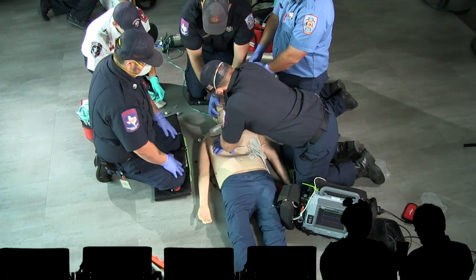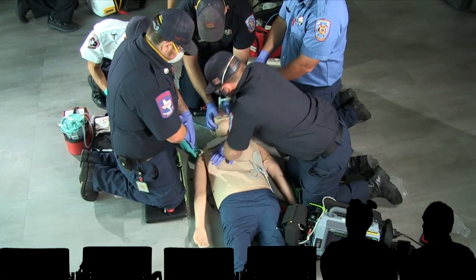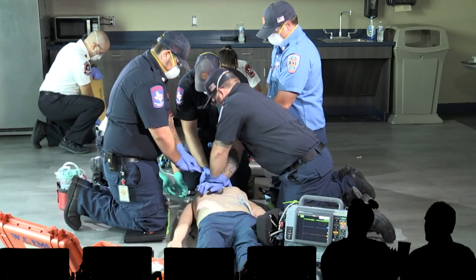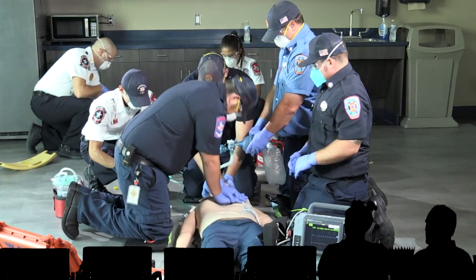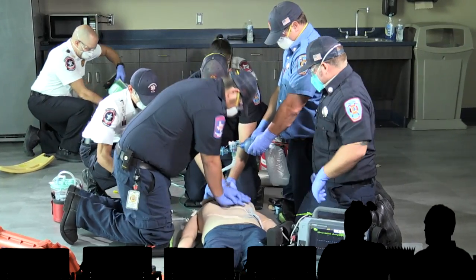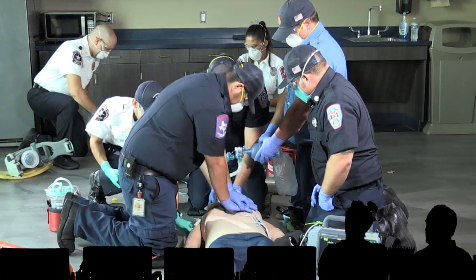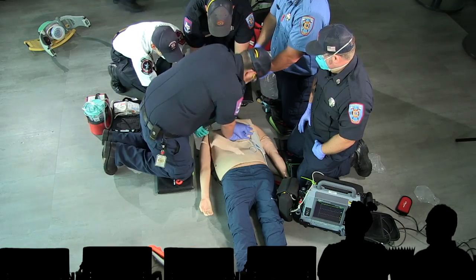It turns out you probably actually aren't going to get hurt if you're touching the patient when you get shocked. I kind of want to try it just to see, but only on a day I haven't had my coffee yet — maybe it'll wake me up to coffee level. They are doing great — very little pause in compressions. Their hands are right over, ready to go. The hover maneuver.